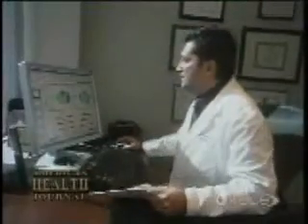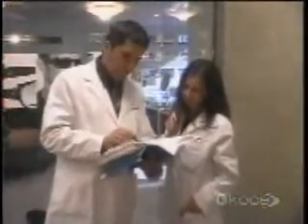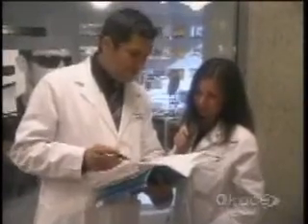The kind of patient for whom this procedure is indicated is a patient who is a poor candidate for laser vision correction, either because they have a cataract, or because their cornea is too thin to have the lamellar refractive procedure, or because they have astigmatism that's too high, or actually, now with the advent of the multifocal lenses that correct not just nearsightedness but presbyopia, anyone over 40.